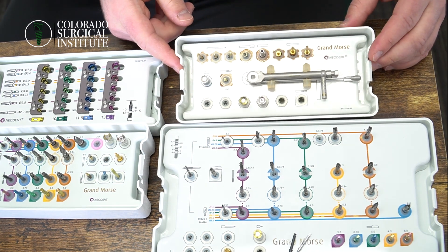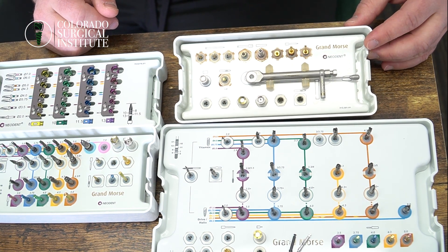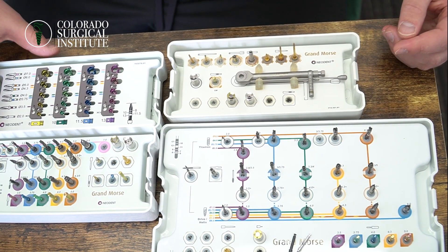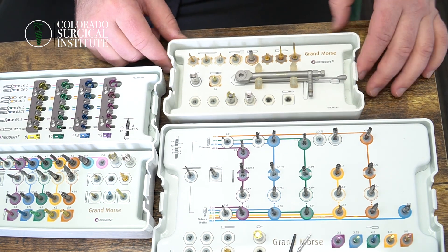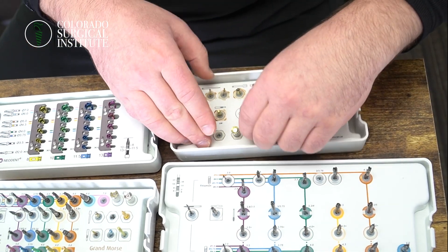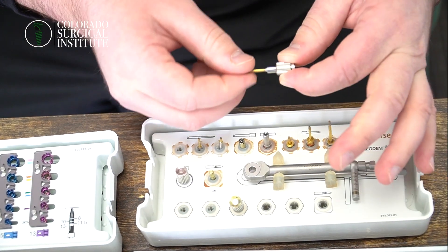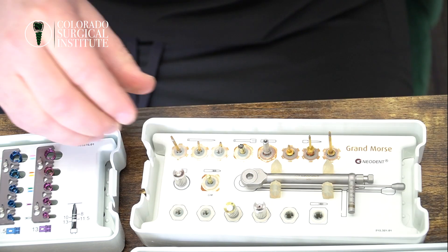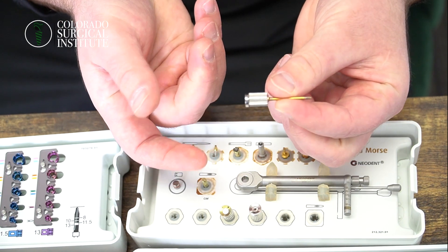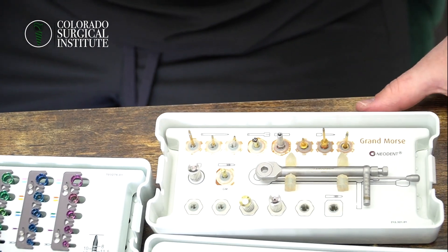The last piece is Neodent's prosthetic kit, which is a separate kit. If you're just seating a crown, you can take this little kit out rather than bring your big surgical kit and having to re-sterilize all those burrs or risk getting them dull. The prosthetic kit has a torque wrench, screwdrivers, attachments in three sizes, and a traditional screwdriver as well. Literally every selection of tool you need — and that about wraps up Neodent's kits.